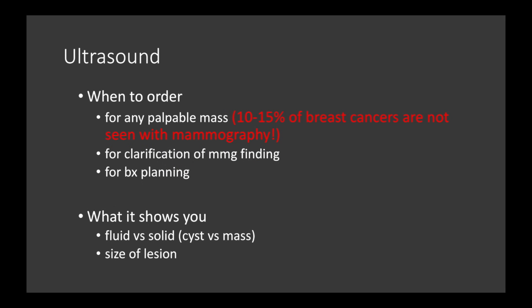Just a short comment on ultrasound, because the most commonly awarded lawsuit in breast cancer is failure to diagnose breast cancer. It's usually in a young woman who has a very dense breast mammographically. She feels a lump, the provider gets a mammogram, it just looks all dense and white and they don't see anything and they say your mammogram looks fine.